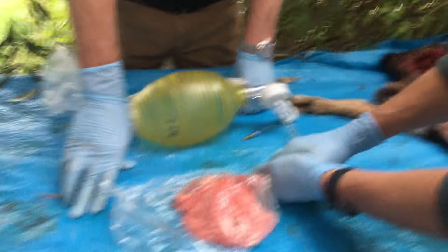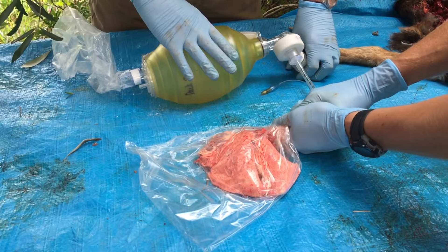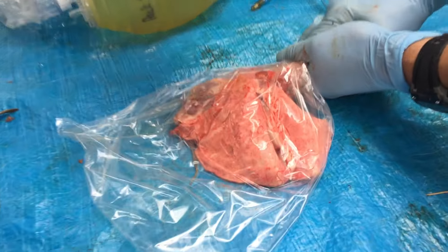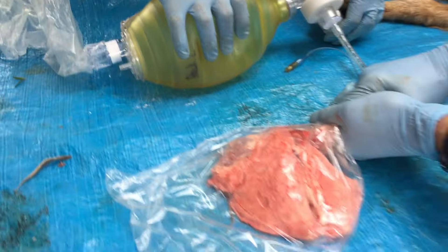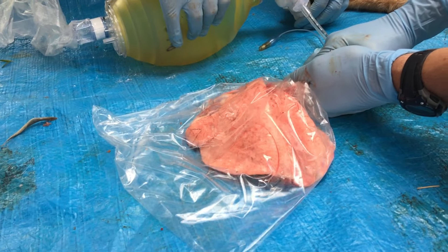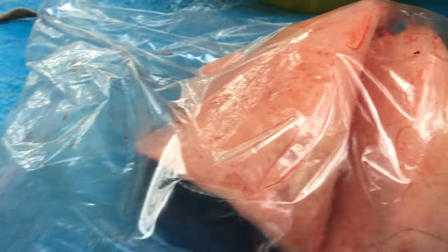A plastic bag — pleura. Here we have some goat's lungs and a heart in there. It's intubated in a plastic bag to mimic the pleura. Now, this lung does have a little hole in it, so we have a pneumothorax — just around the side, just a little wee punctured lung.